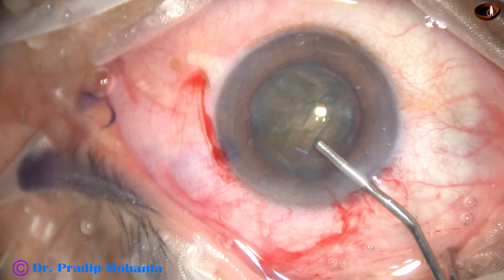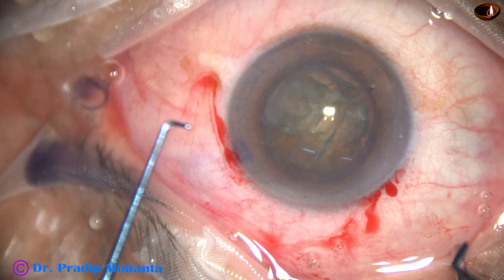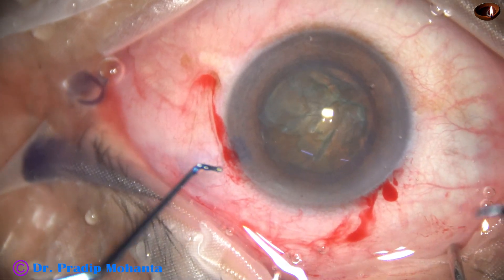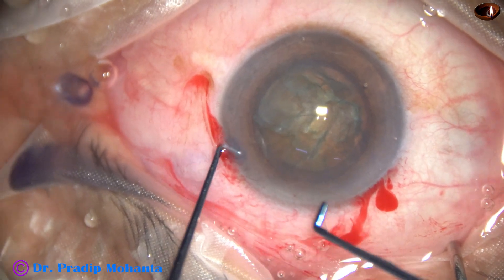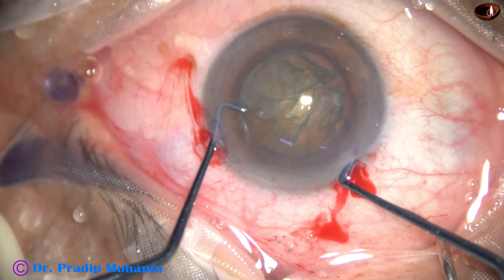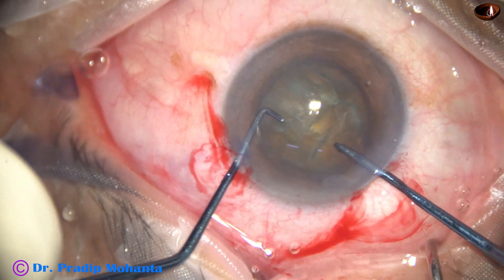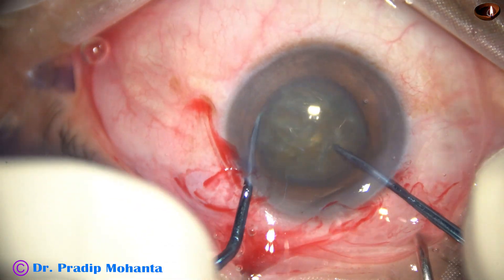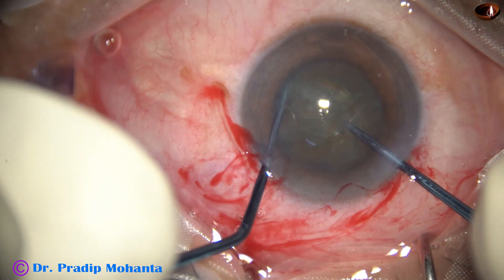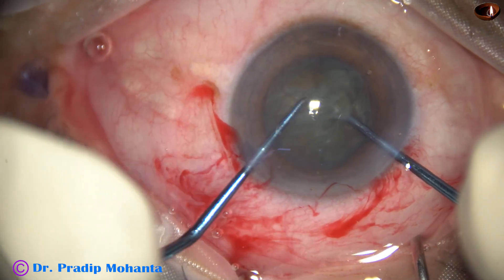This is the third video clip. Pre-chopper and sustainer. The sustainer goes in first, then the pre-chopper. The pre-chopper engages in the soft part. The sustainer hooks the opposite equator, 180 degrees away. The two instruments come to each other and lateral separation is done.